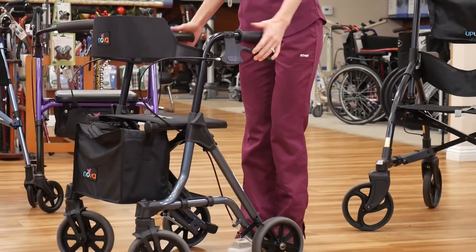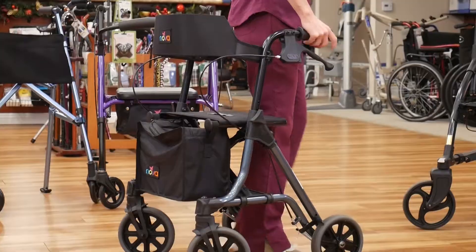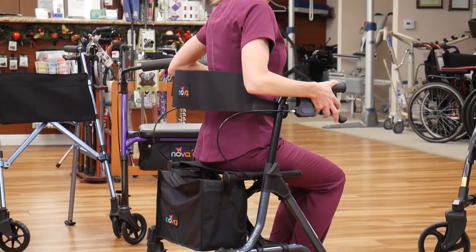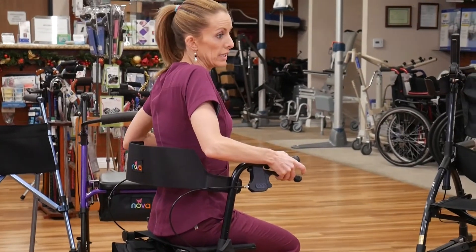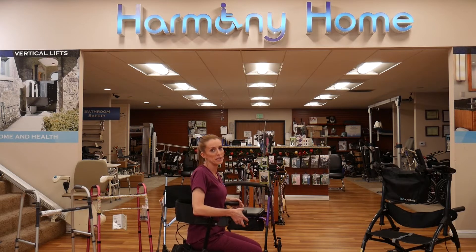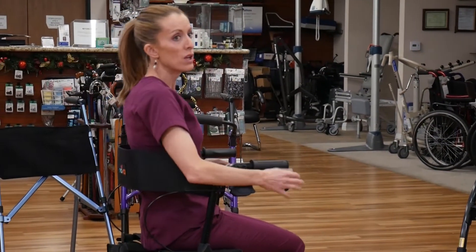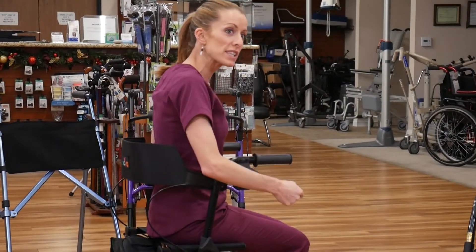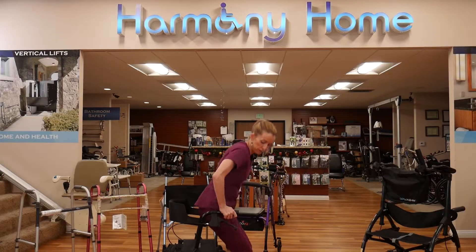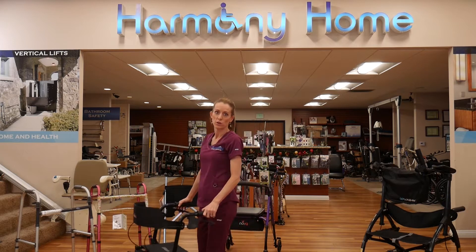A rollator has handbrakes — you push them down to have them lock in place. It's really important to do this before you sit down. You can turn around and sit down on the device once the brakes are engaged. Do not release them and scoot around, because while it might seem easy to get around that way, it's very dangerous. These are not intended to be used that way — they're very back-tippy. Always keep the brakes engaged when sitting down and when you go to stand up. Then you can stand up from the device and squeeze the brakes to move on to your next spot.